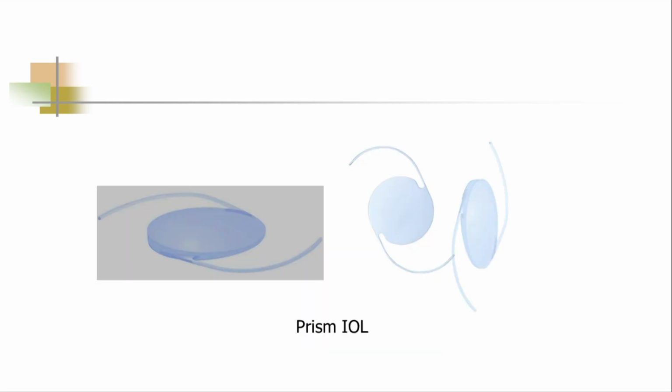This is called a Prism IOL. This IOL can be used in cases where there is stable macular disease and loss of central vision. The lens incorporates a prism which shifts the image from the diseased part to an extrafoveal position, thus enabling the patient to see better. An easily identifiable prism base ensures proper insertion and location within the eye. This may be a useful tool in place of aggressive retinal translocation procedures.